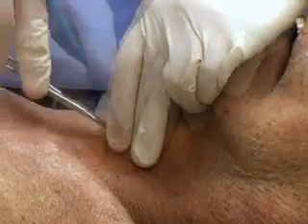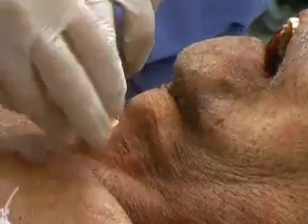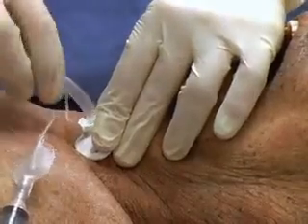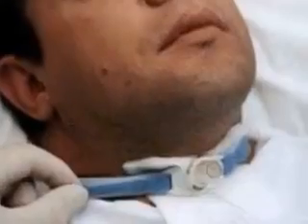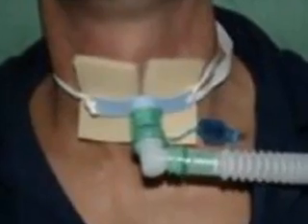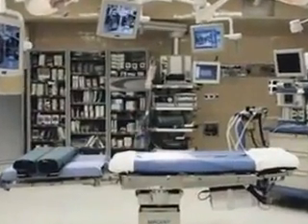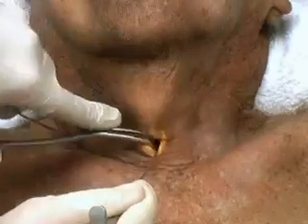This video is intended as a teaching tool for those learning the procedure. A cricothyroidotomy performed under emergency conditions can be left in place for up to 72 hours. If a surgical airway is still necessary after 72 hours, the cricothyroidotomy should be converted to a tracheostomy. While tracheostomy is preferred for long-term management, it should be performed in the controlled setting of the operating room. In urgent situations, cricothyroidotomy should be performed.